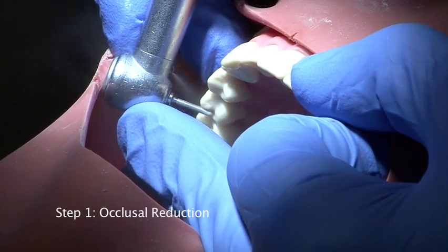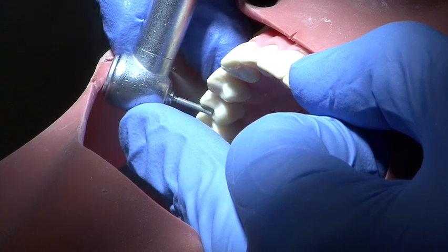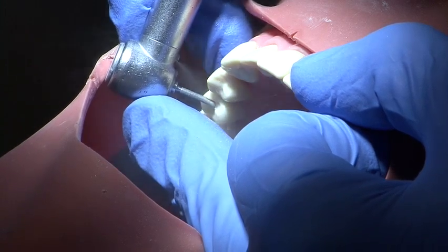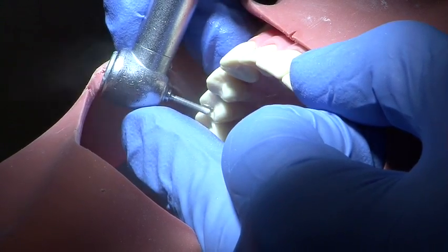Occlusal reduction is carried out using a parallel sided medium grit round ended burr. The buccal cusp is reduced to a depth of 1.5 to 2mm to allow room for metal and ceramic. The outline of the cusp is retained at all times to maintain resistance form.